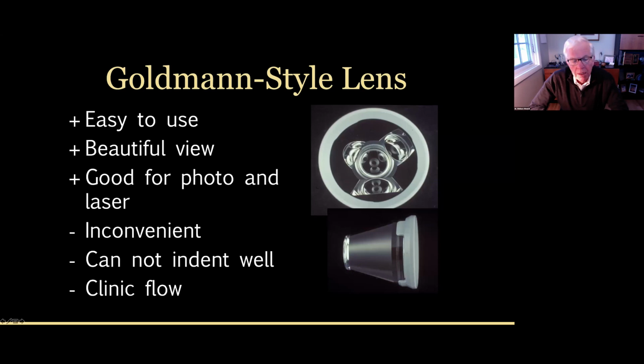The downsides of the Goldmann lens: it's more inconvenient because you need to use a coupling solution. Because it has such a big area of contact, you can't indent easily with this lens. And the last point there is clinic flow.